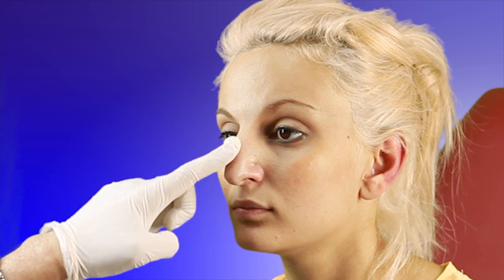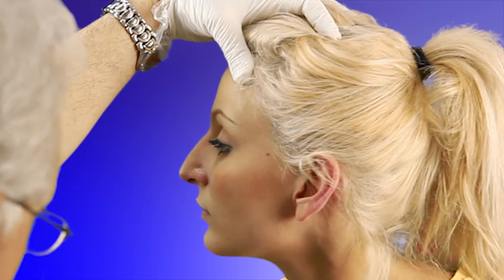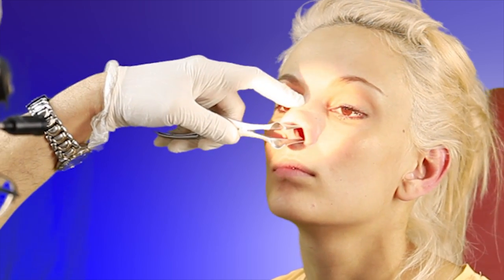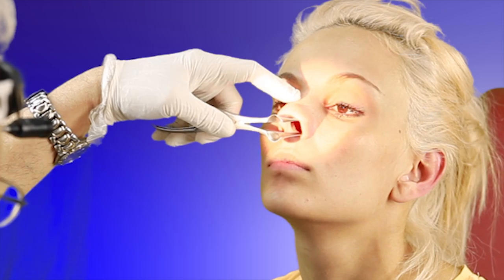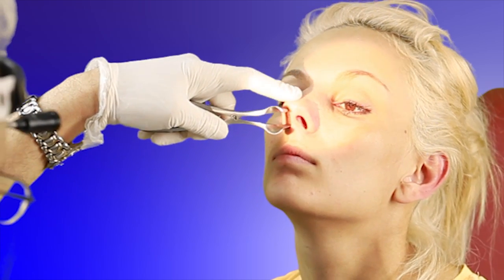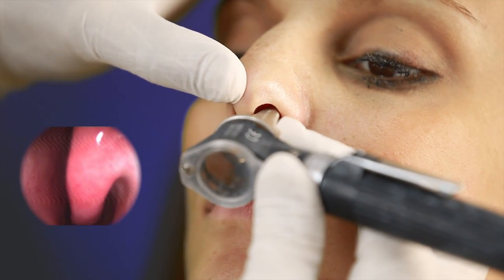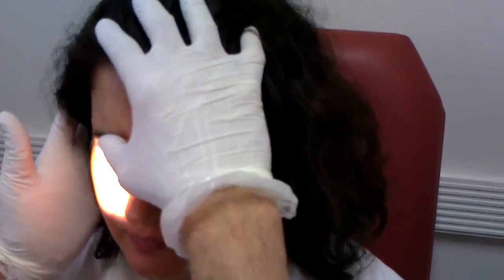Nose: the external nose should be inspected, looking for asymmetries, and palpated. Perform rhinoscopy with a speculum and/or an otoscope. Press and percuss the anterior walls of the maxillary and frontal sinuses.